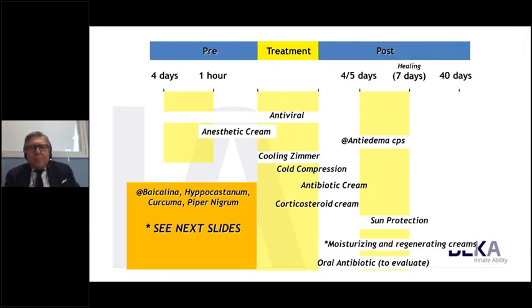I never use oral antibiotic unless we are treating very large, extensive surgical indications. In the case of acne scars, you have to stop any kind of isotretinoin treatment 1 month before the treatment. We must be very, very careful in the treatment, and the skin must present no inflammation where we treat with the fractional CO2 and with the freehand.